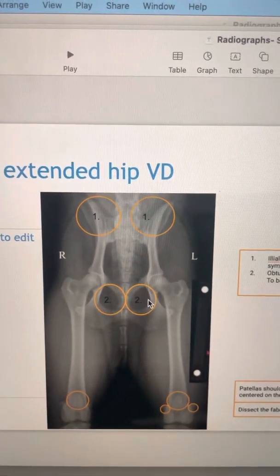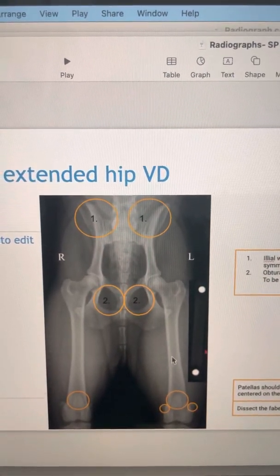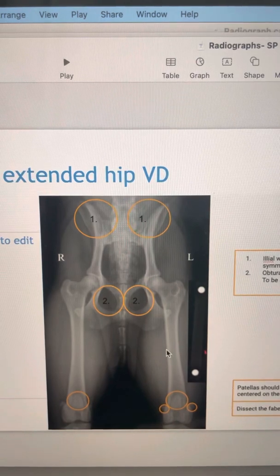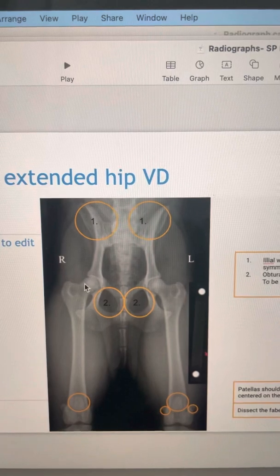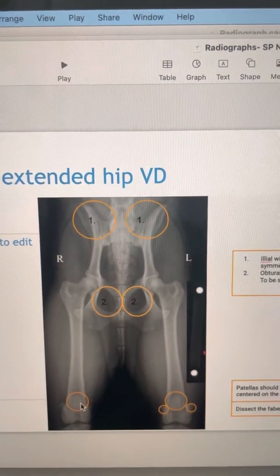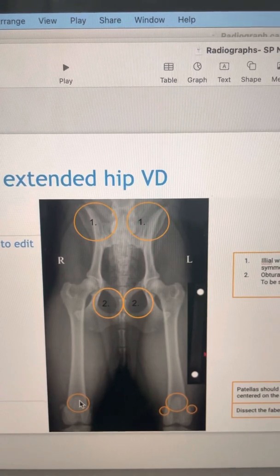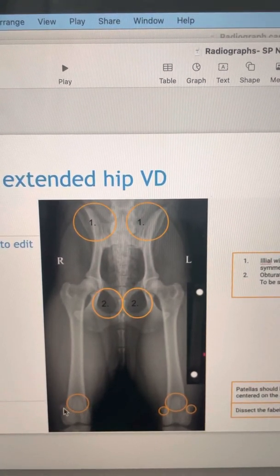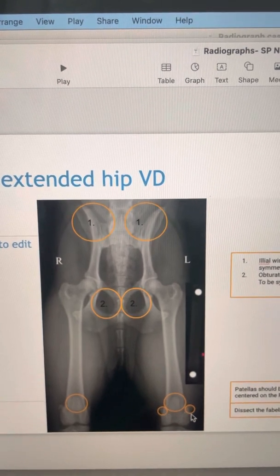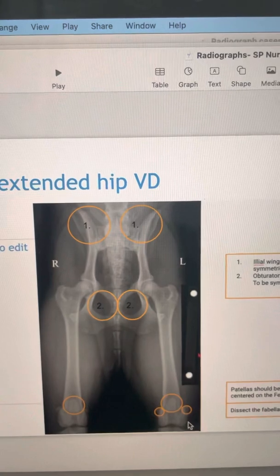When specifically taking the hip templating x-rays, I don't mind if it's an extended hip VD shot or a frog-leg view. The standard view is to have the hip extended, which is what we've achieved here. Ideally we want to try and get the patellas in the centre of the trochlea, and we want to get the fabella bisected by the cortex of the femur on the medial-lateral side, just to make sure everything's lined up nice and straight.